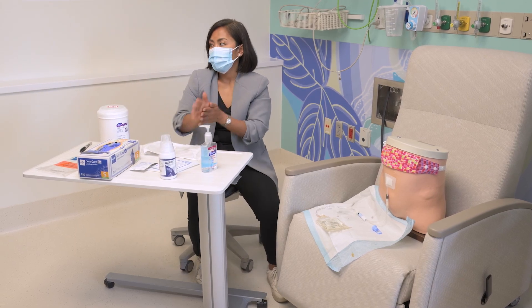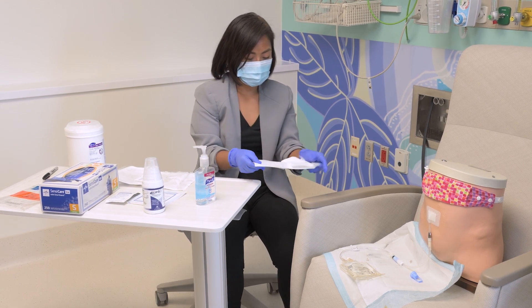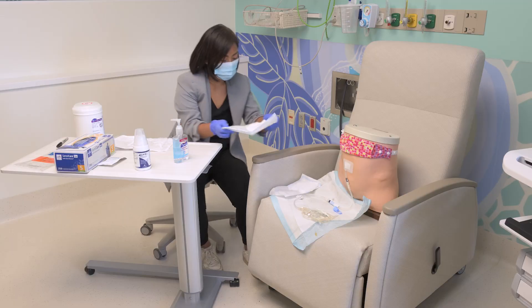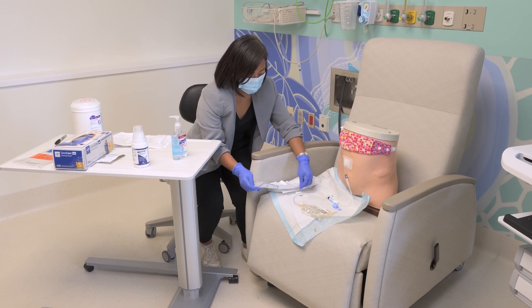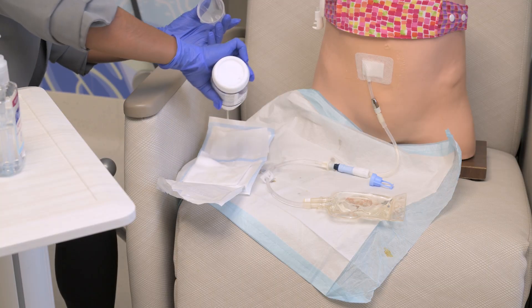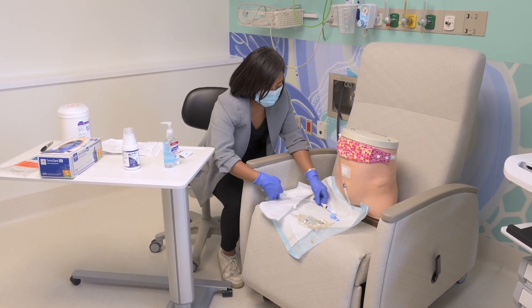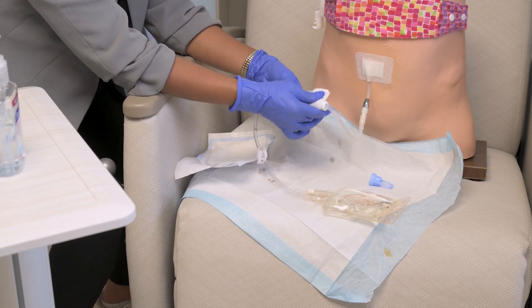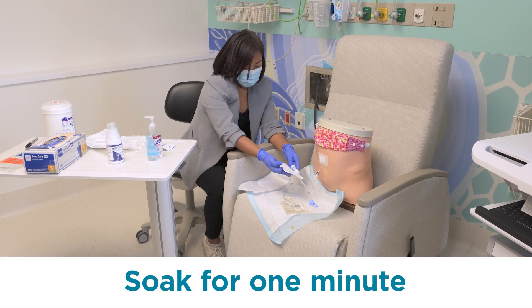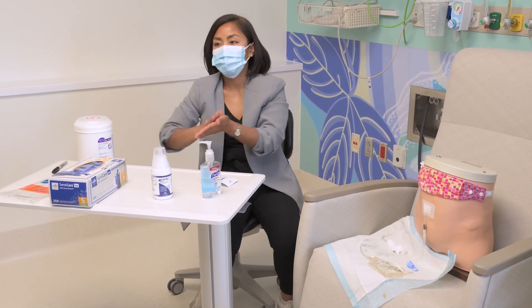Gel hands and put on new gloves. Open two new packages of gauze. Pour or spray Alcavist on both pieces of gauze. Clean the transfer set with one piece of gauze, then use the second 4x4 gauze saturated with Alcavist to let it soak for one minute. Change gloves: do hand hygiene and put on a new pair of gloves.